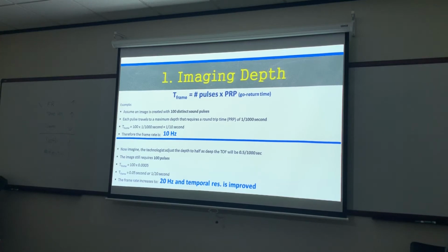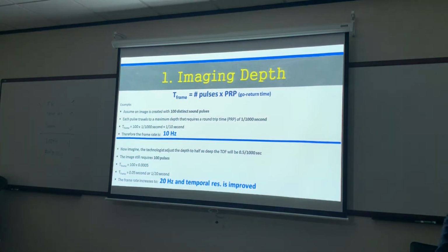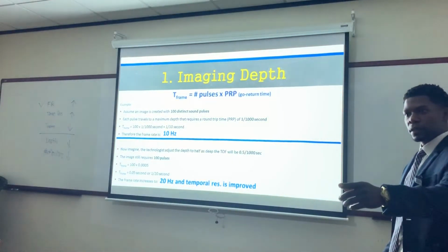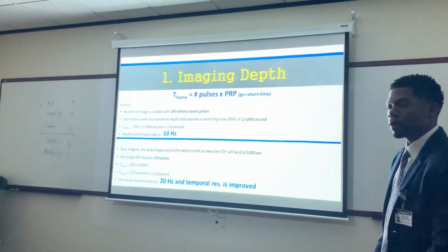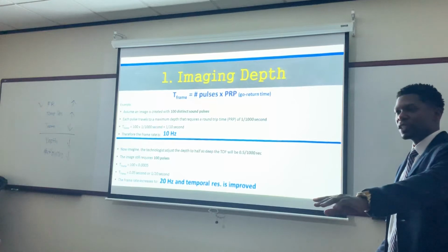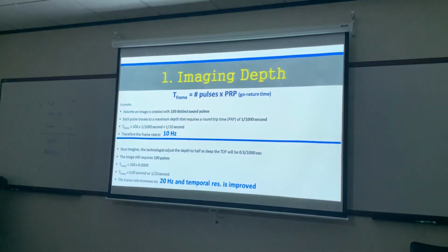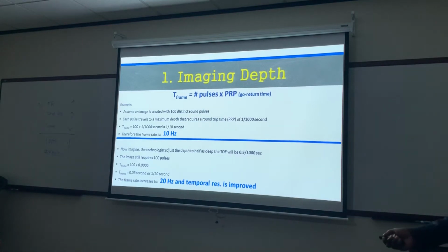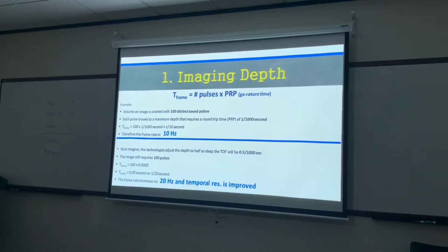Okay. Same thing, just like with axial resolution, we like the high numbers, right? That's going to provide us with better temporal resolution. What's wrong? Is it the lower numerical value? No, I'm tripping. You're right. On axial resolution, it's a lower numerical value. Just the opposite then. Okay. So 20 hertz is going to be better than 10 hertz when we're concerned with resolution.